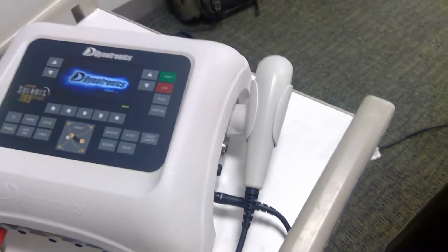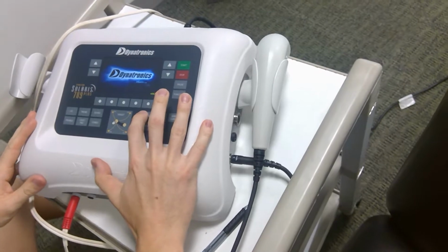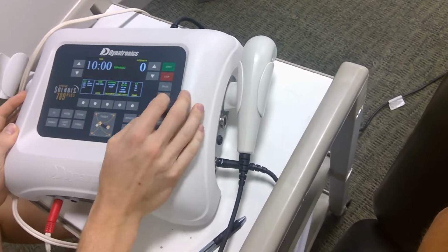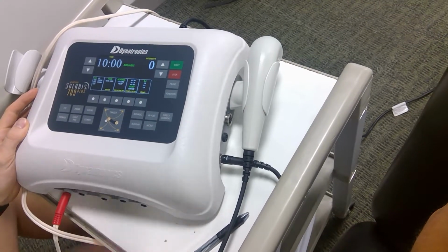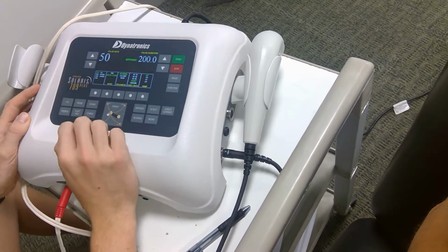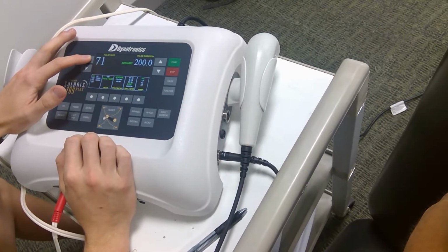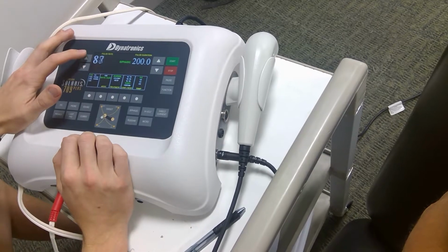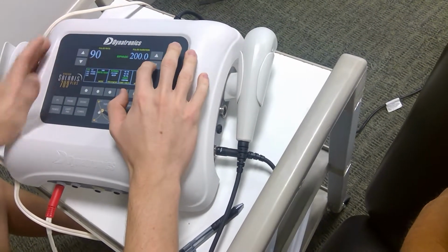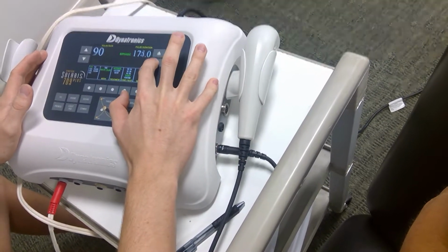If you wouldn't mind holding this for me. Alrighty, so first off, I'm going to turn the machine on. I'm going to come here to biphasic pulsed current, and since we're doing high frequency, I just want the on-off ratio to be continuous there. Then I'm going to come in here to rate and duration, and I'm going to bump my pulse rate up to 90 pulses per second, and then I'm going to bring my pulse duration down to 100 microseconds here. So this is going to take a little bit.